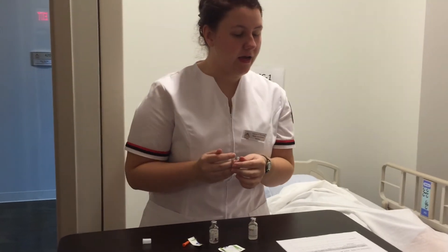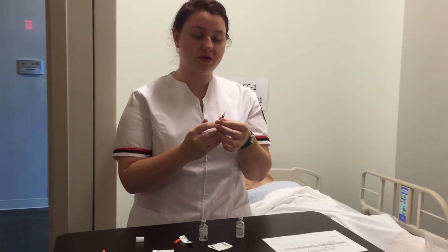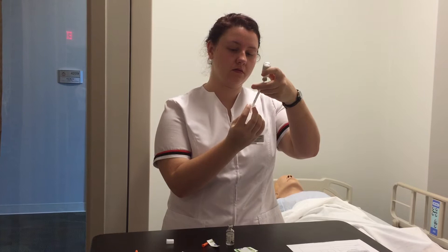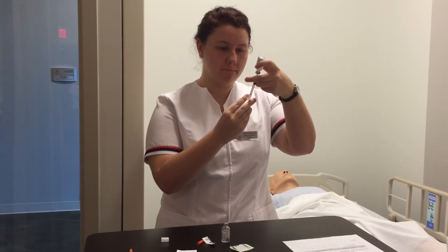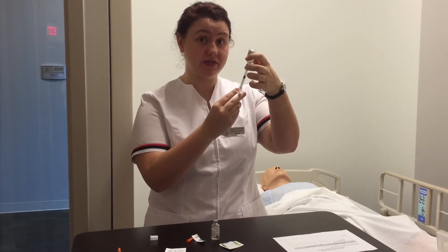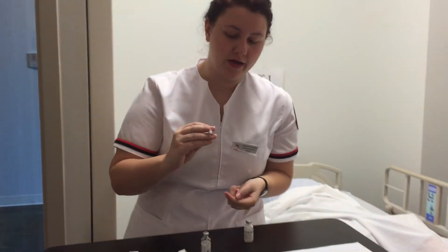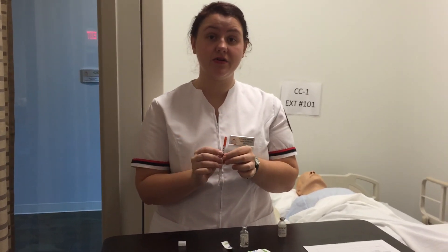I pull it out and now I have to put in 20 units of NPH insulin. Since I already have 12 units in the syringe, I'm going to pull back to 32. I check for air bubbles — I have it at 32 and there are none. I cannot put any back into this vial. I pull it out at 32 units, safely recap my needle, and I would go verify it with another registered nurse.